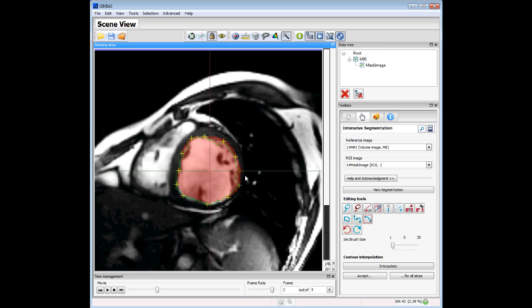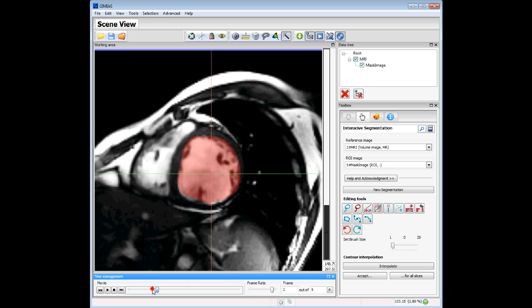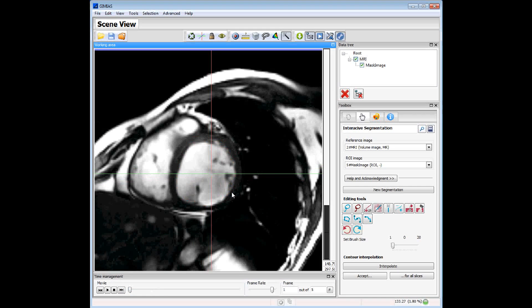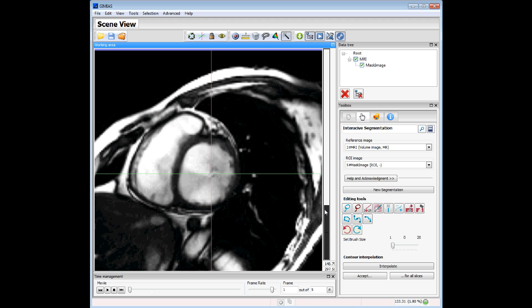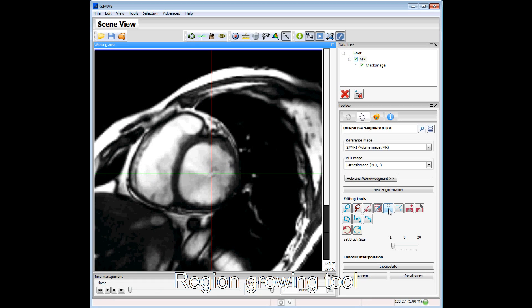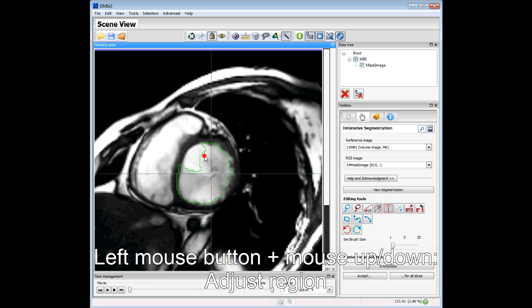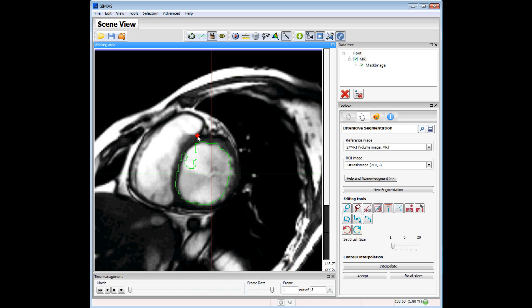These are the features of this contour segmentation. We deselect the tool and come back to the first slice. Now we will go to another slice and use another tool. For example, we can use the region growing tool. You can see the region growing — we can move the mouse up and down to adjust the region.